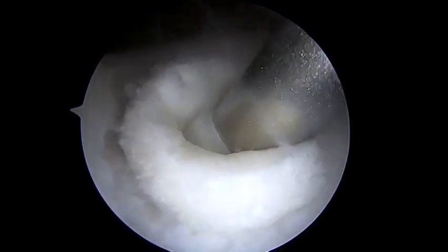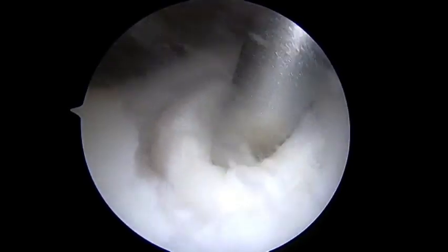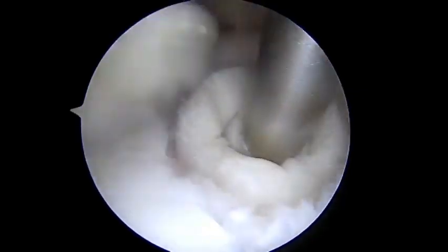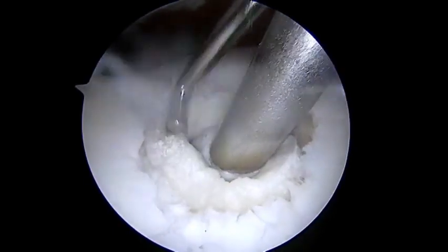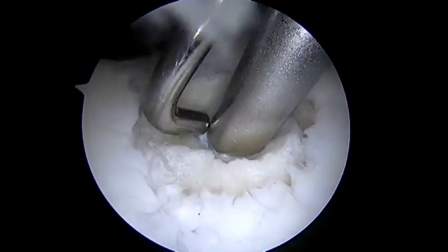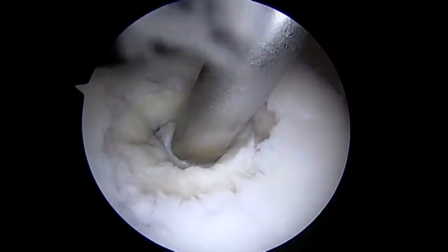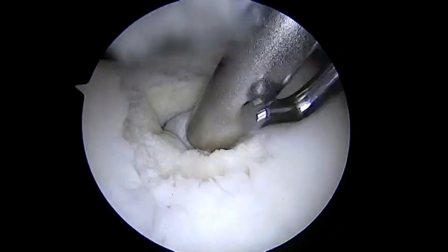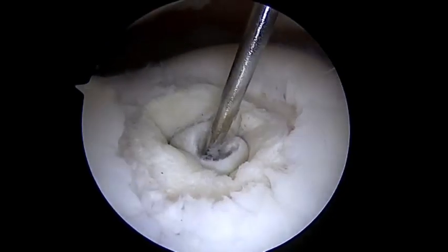Each full turn is approximately 0.75 of a millimeter. It allows the surgeon to tailor the level of repair with respect to surrounding tissue. Typically, the aim is to be at least 0.5 millimeters countersunk with respect to any tissue to allow the graft to be an augmentation of this osteochondral tissue space. I'm using a probe here to palpate the surrounding tissue.